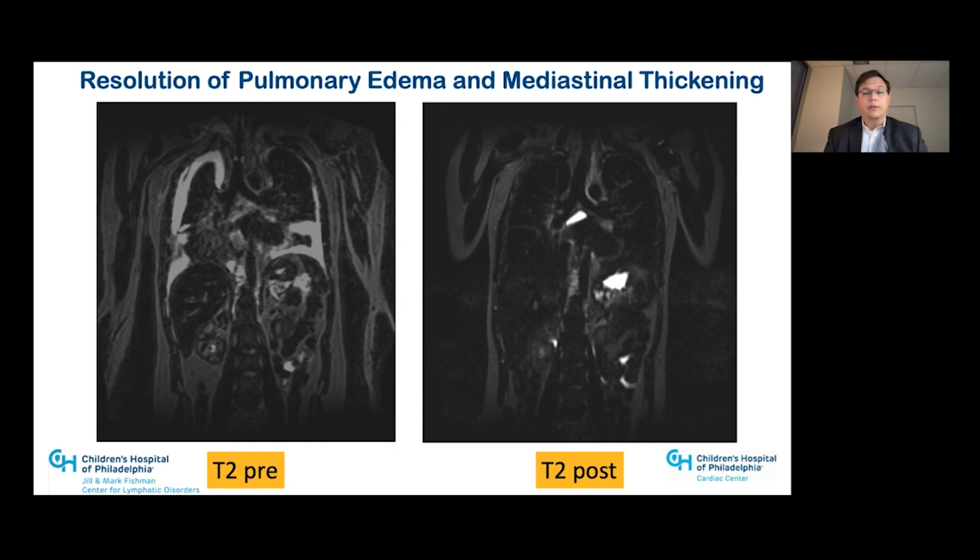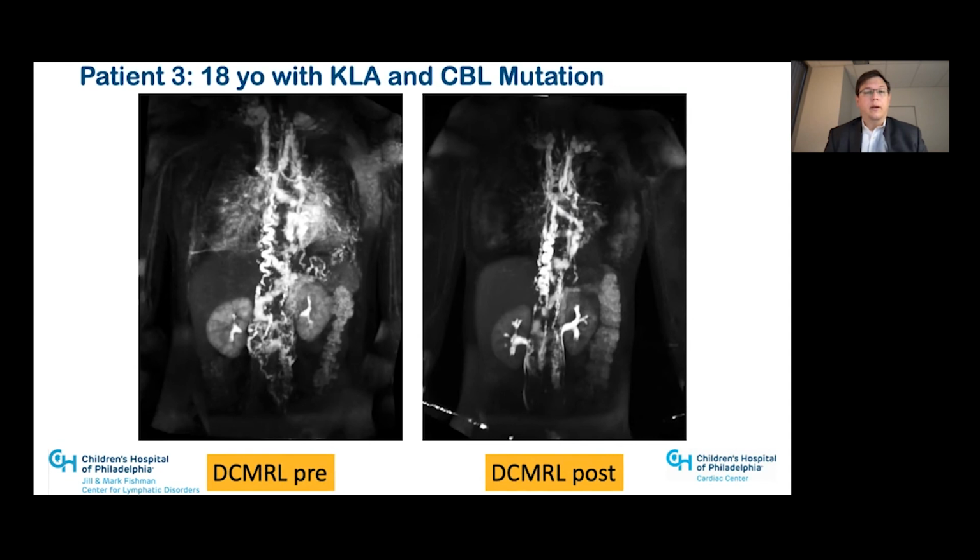It translated along with the dynamic component of the MR lymphangiography. This shows a significant perfusion of the lungs on the left, but on the right, with treatment, we see a significant remodeling of this, with much decreased perfusion towards the lungs, which all correlates with her disease state. So this is definitely one way that we can follow along with the different disease treatments that are available.